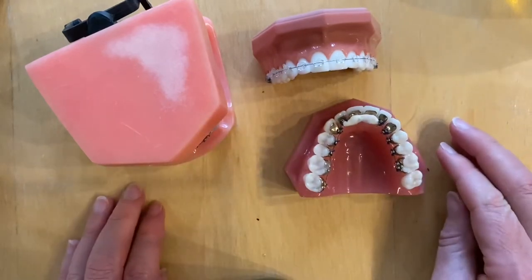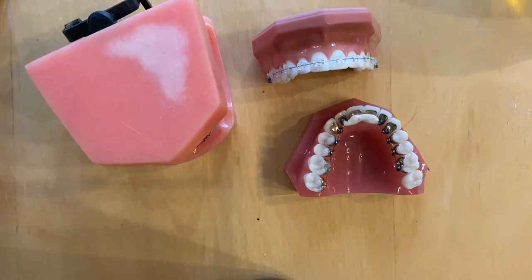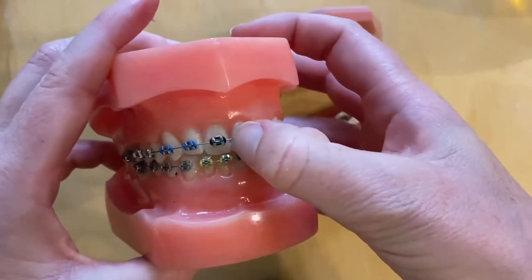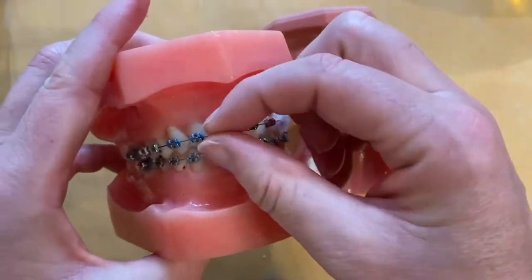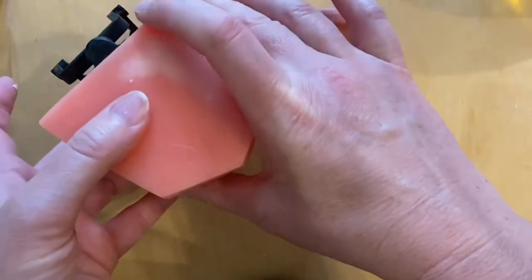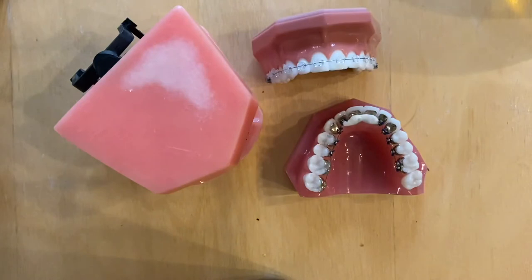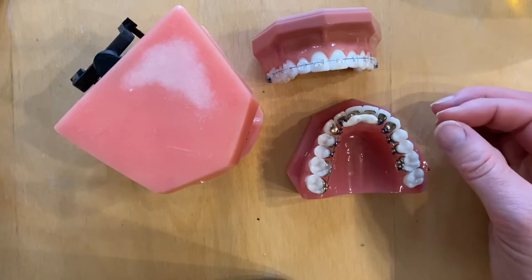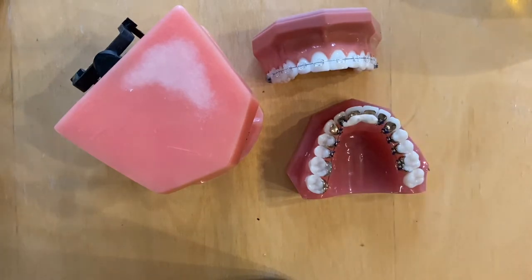In terms of eating and drinking, it's best to avoid anything that might harm the braces. Things that are very hard or very chewy can make the wires distort or break the brackets off the teeth. Avoid chewing gum, which tends to affect the wires and make them bend. It's also a good idea to avoid anything very sugary or acidic, including sweets and fizzy drinks, and to avoid snacking between meals or eating things close to bedtime.